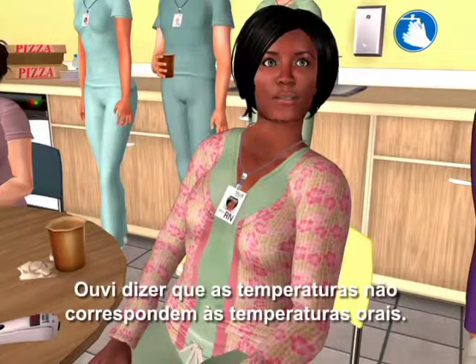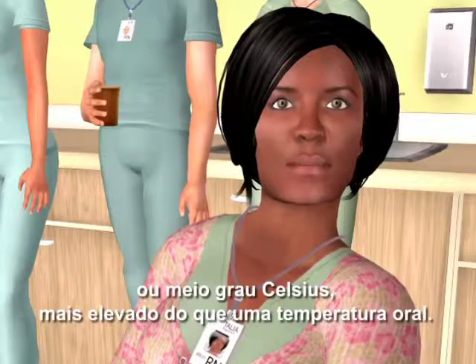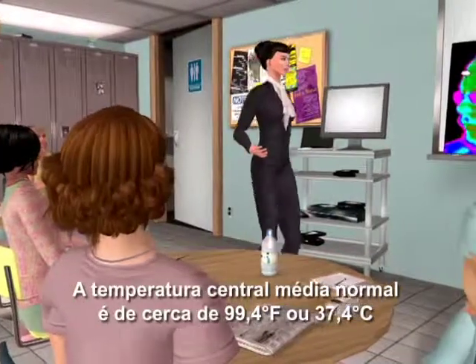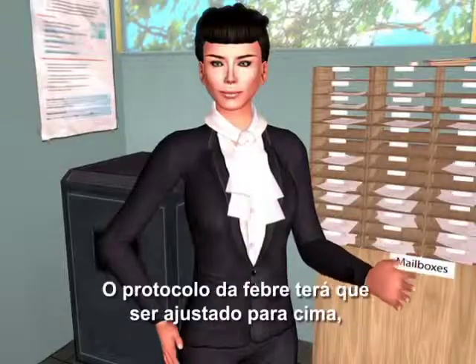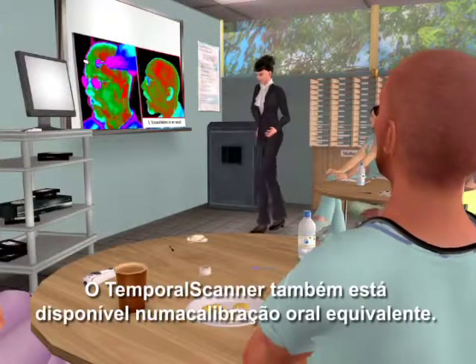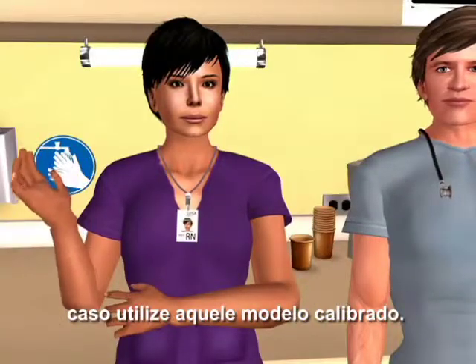I've heard the temperatures don't match oral temps. The temporal scanner is measuring core temperature, about one degree Fahrenheit or half a degree Celsius higher than an oral temperature. The mean normal core temperature is about 99.4°F or 37.4°C versus about 98.6°F or 37°C for an oral temperature. FIVA protocol will need to be adjusted upwards if your current protocol is based on an oral temperature. The temporal scanner is also available in an oral equivalent calibration, in which case no adjustment is required.